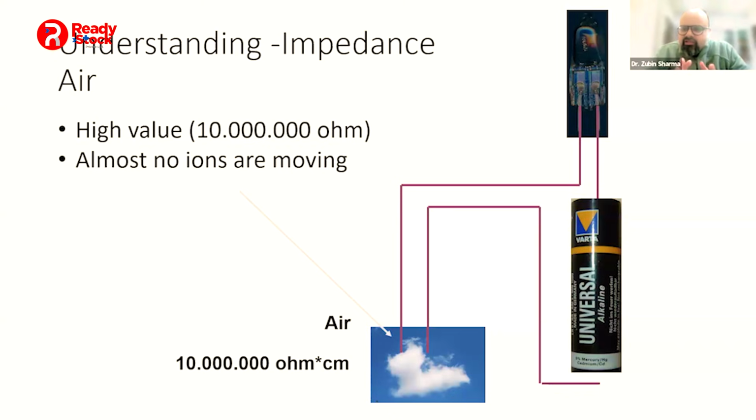Impedance is just the flow of current in between two conductors or two sensors. In terms of the catheter that you will be using, those are two metallic rings on the catheter. But in between that conductance, there has to be a resistance to the flow of the current. How much current can actually flow?